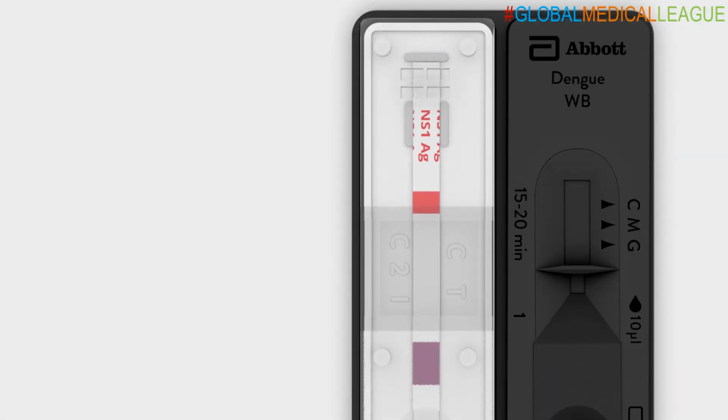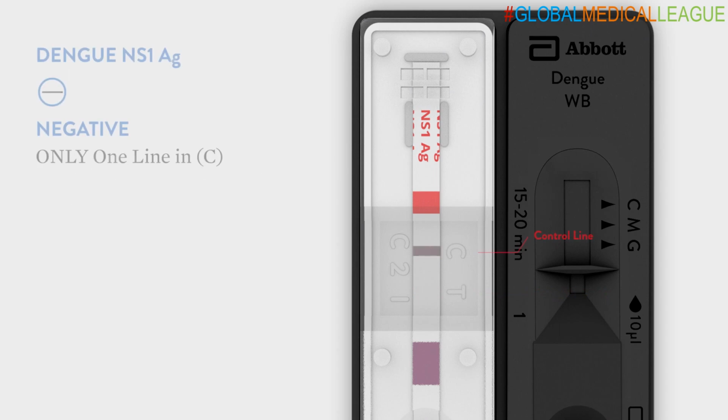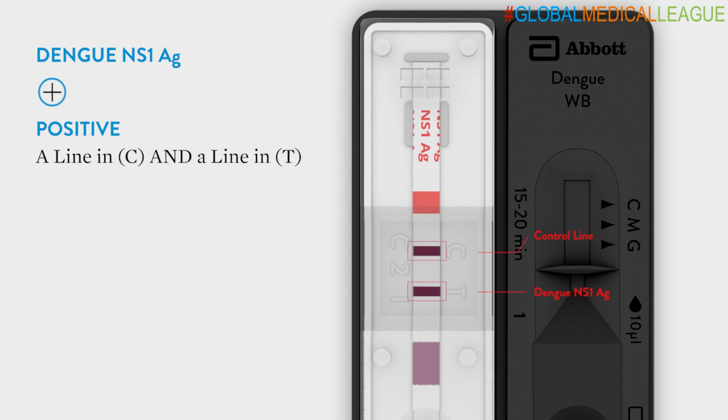Dengue NS1 antigen test. The test line T is specific for Dengue NS1 antigen, and C is the control line. Please note that visible test lines should be considered reactive even if faint. Only one line in the control line C means it is negative for Dengue NS1 antigen. A line in C and a line in T means it is positive for Dengue NS1 antigen.